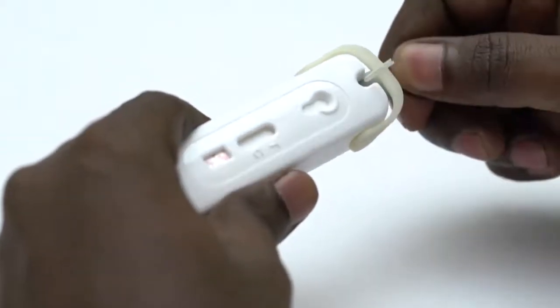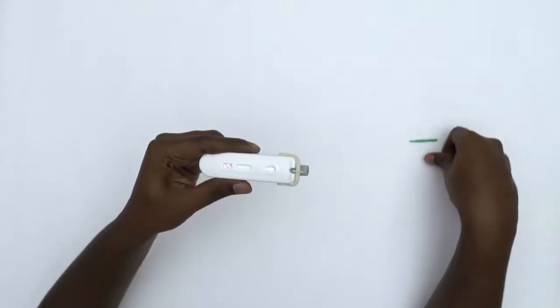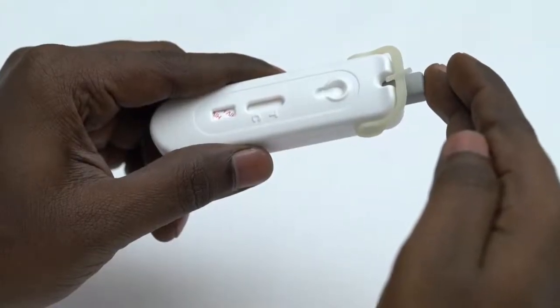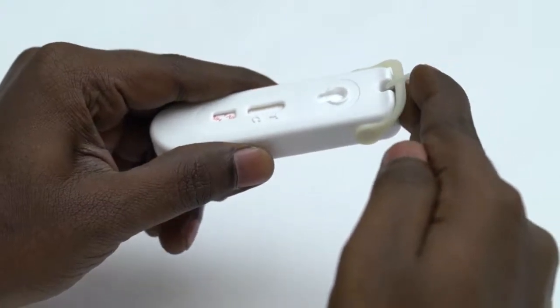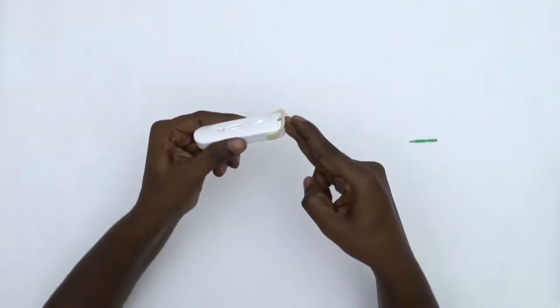To remove the green tab, first gently turn, then take it out and discard it. The grey button is used to prick your finger and can only be used once. Firmly push the grey button in to prick your finger — it only pricks once.